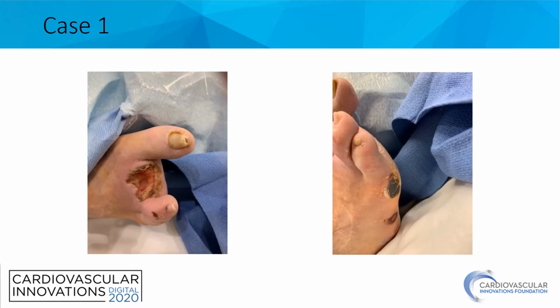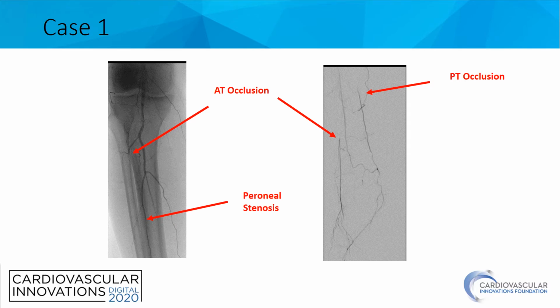Here's what his foot looked like when he presented to our facility. You can see he has this non-healing wound bed, as well as a lateral distal necrotic-looking ulcer as well. We brought him to the angiographic suite and performed an angiogram.